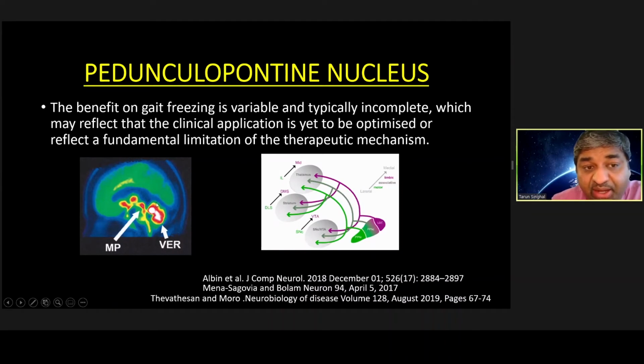structure. And with deep brain stimulation, for example, the benefits are highly variable, and improved delineation of this structure can lead to an improvement in patient outcomes. There is heterogeneity within the pedunculopontine nucleus itself along its rostrocaudal length and its horizontal diameter. And therefore, a higher resolution imaging of the nucleus will definitely aid in more precise targeting of this region.